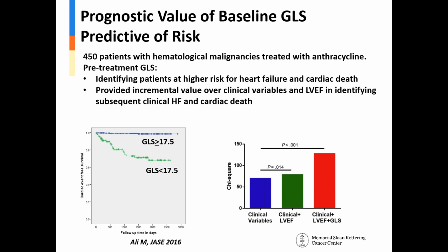Thanks, Bob. This is Lauren. Just one logistical comment, and I'm going to echo what everybody else has been saying. One of the things we've done in our echo lab to help facilitate this type of communication, and as Dinesh pointed out, to prevent the immediate stopping of therapy if there's an abnormality, is to create a drop-down menu of specific phrases for specific findings, with gradations. Some things are green or yellow and just go in the report, other things trigger a phone call, and we have specific language about referring to cardio-oncology.